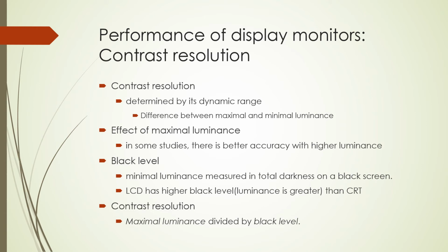Minimal luminance is also called black level. Black level is the minimal luminance of a monitor measured in total darkness with the entire screen black. LCDs have higher black level than CRTs. Contrast resolution is the ratio of maximal luminance and black level.